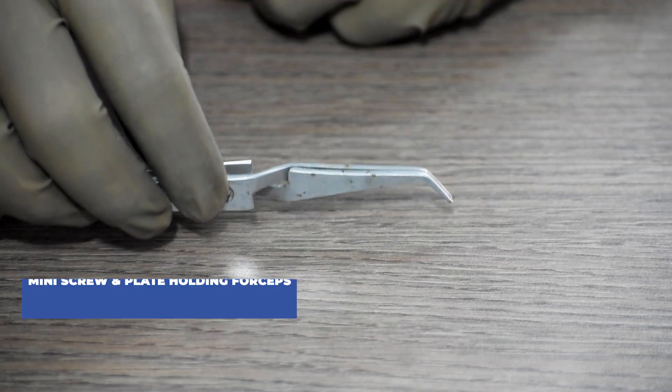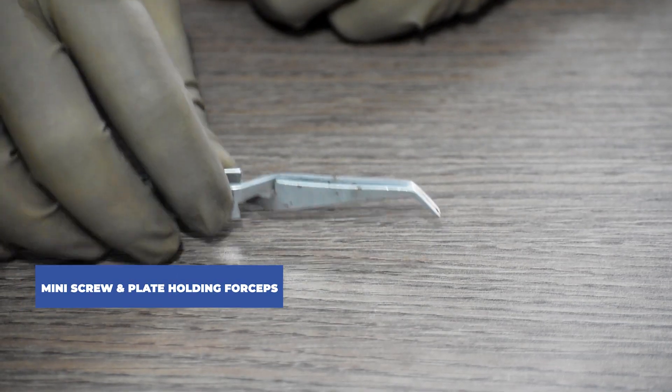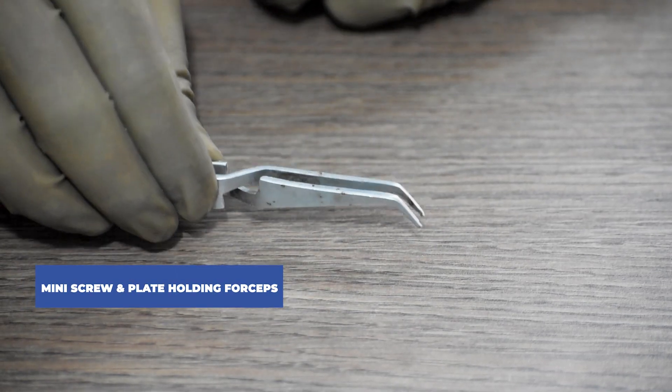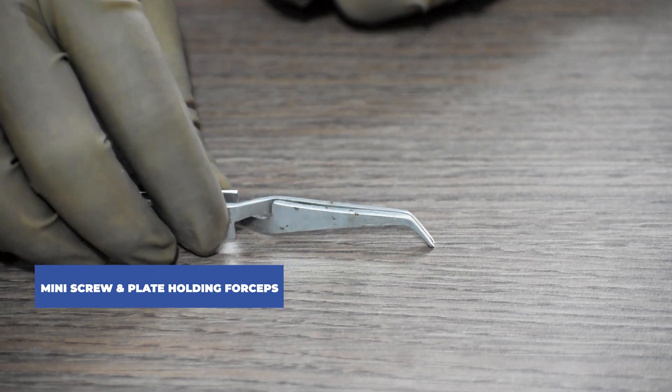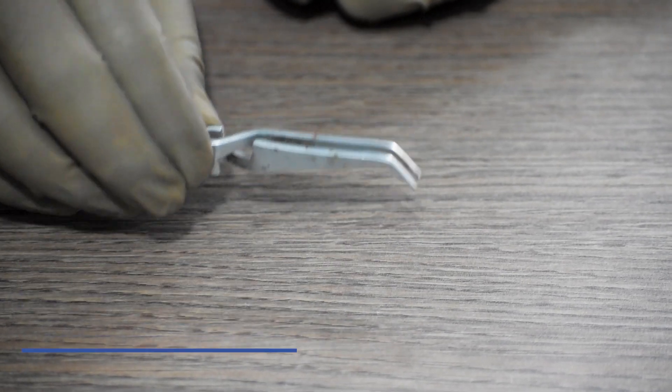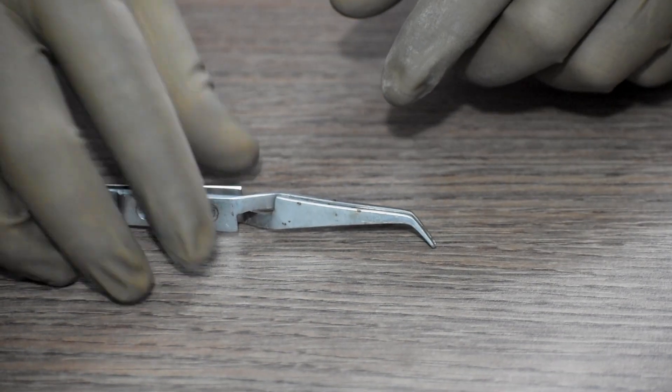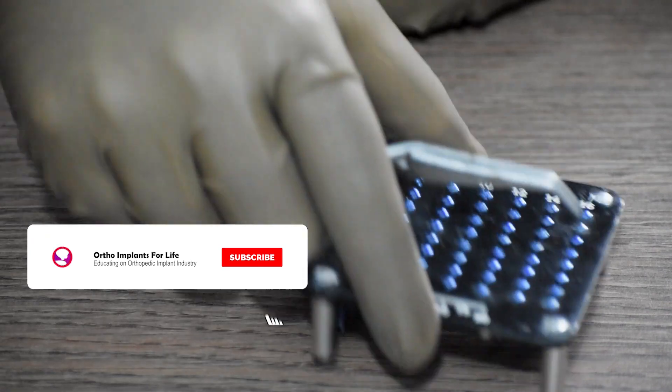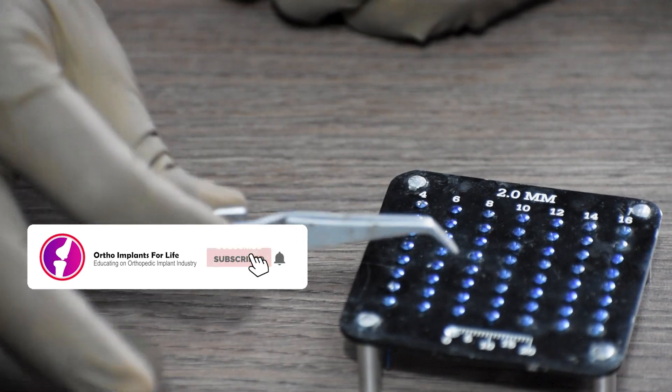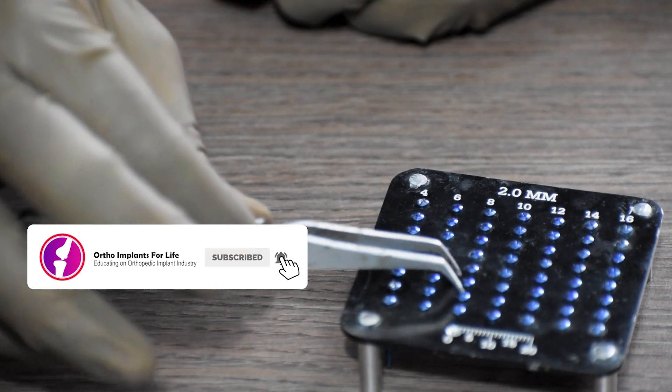Next is the mini screw and plate holding forceps. It is used to hold the plates in the fracture site or to pick up screws.